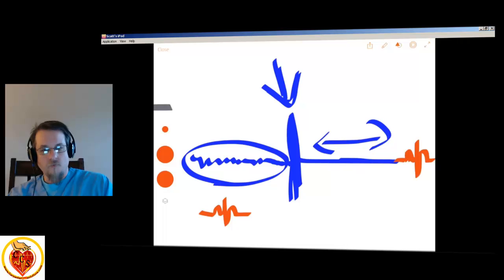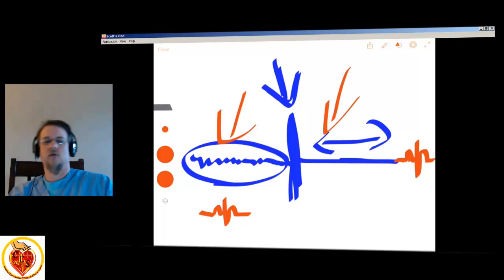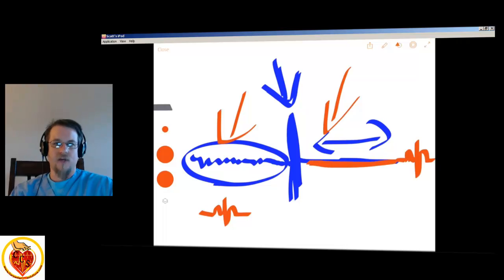Now, studies show you have a much higher chance of success if you perform high quality CPR here immediately before the AED takes over. And you get right back on the chest here during this absolute refractory period when there is no electrical activity and you perform high quality CPR.